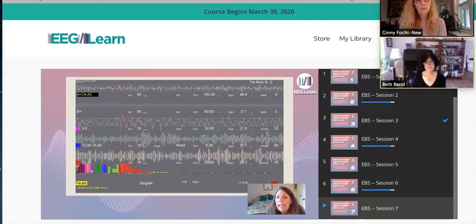And if it's coming in average of 21.6 microvolts, I've set the ceiling of that threshold. Again, I'm giving them a little bit of wiggle room, but I don't want it to go above 24 microvolts. And again, I use that percentage column to help me at least have a moderate challenge level there without it being the primary focus of my training, right?